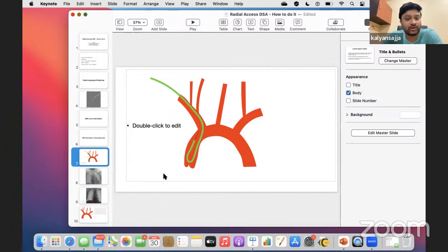In some cases where you're not able to, when you shape the SIM in the ascending, it's a different configuration. And when it's in the descending, it's a different configuration. So if it doesn't work with one configuration, you can always try the other.